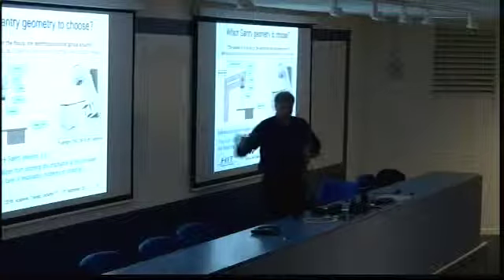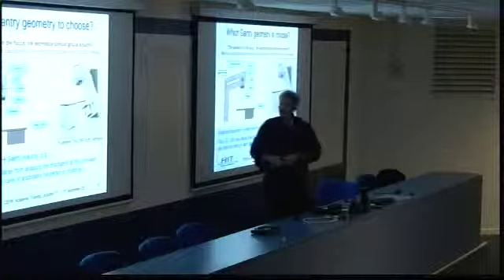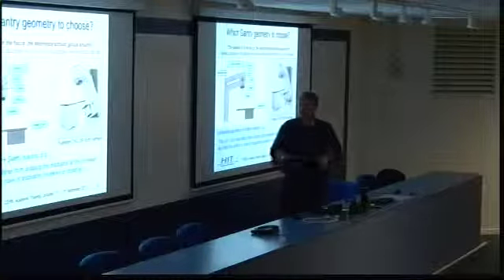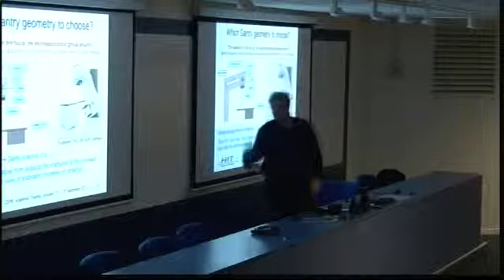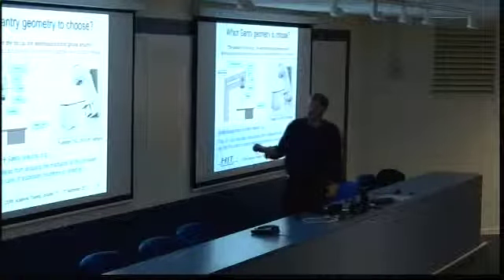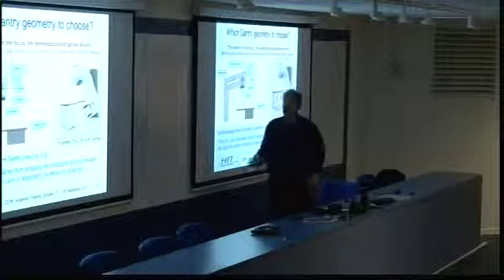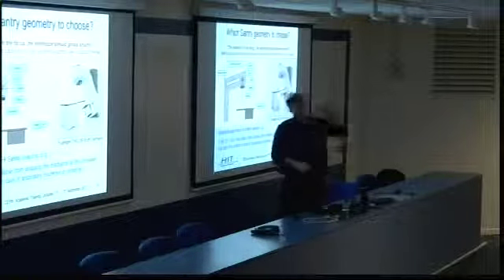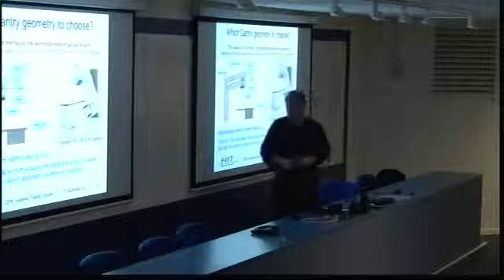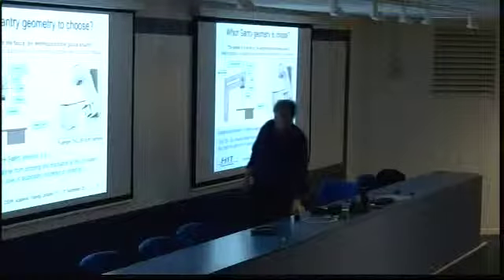As you know, such a treatment room is a fixed room. You have to open the door. Sometimes it's a bigger door for radiation safety, or you have a long floor to cross. So 20 to 30 seconds is really a hard task. And if you had an eccentric gantry where you have to cross 2 or 3 levels to come to the patient, in my mind, it wouldn't fit.